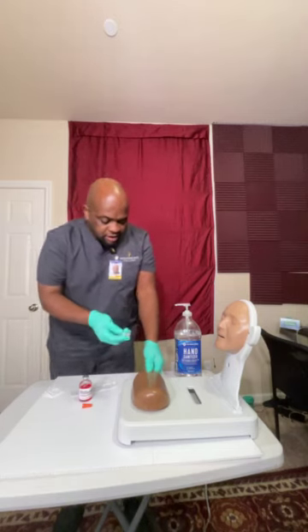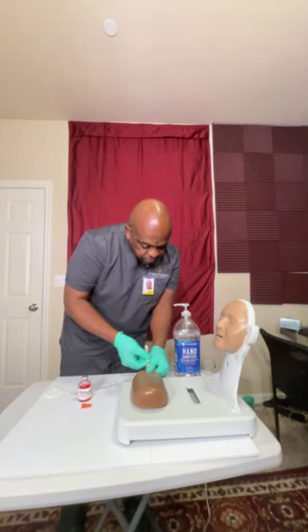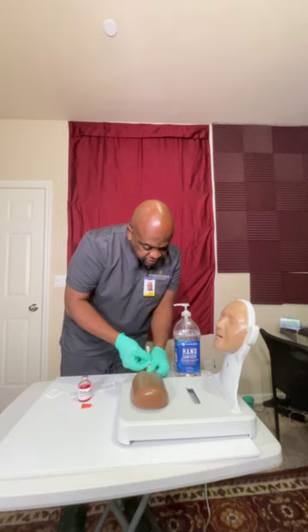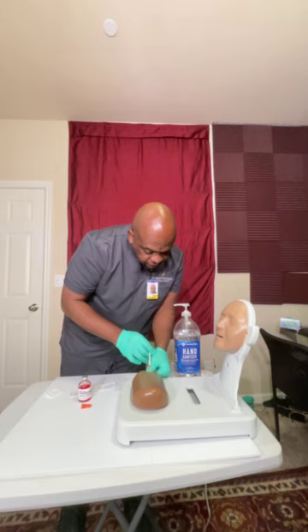And I'm going to come in at a 5 to 15 degree angle to put the syringe into the skin. As I feel some form of resistance, then I'll proceed to go in a little bit more. And with my dominant hand, I'm going to push in the medication, 0.1 milliliter.